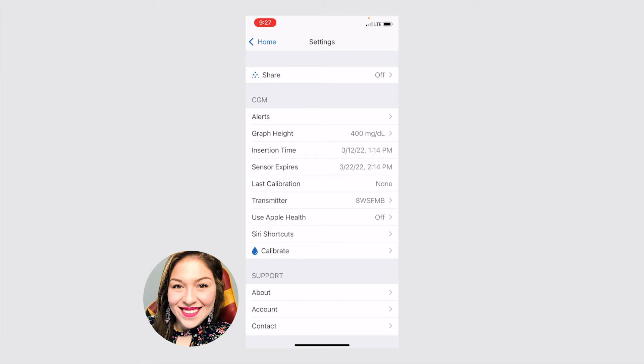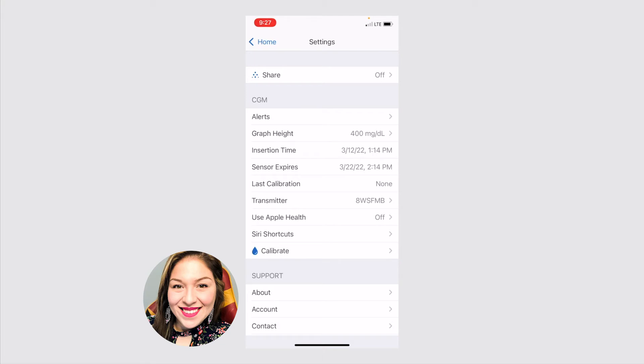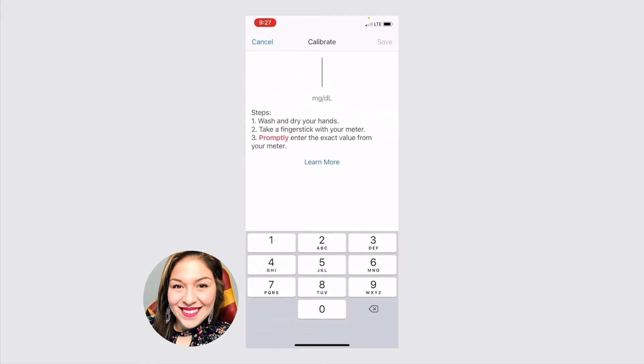The last option I want to highlight is the calibrate. The Dexcom G6 sensor does not require calibration. And so what calibration means is you'll test your blood sugar with a regular blood glucose monitor. And then you'll tell the sensor, here's what my real blood sugar number is, to make sure that the number from your sensor and the number from your blood glucose monitor match as much as they can.